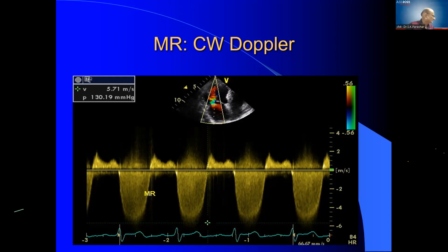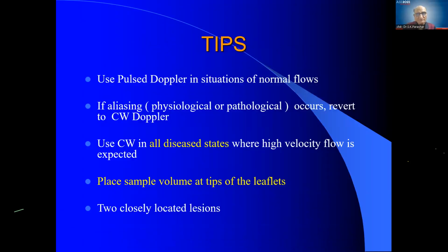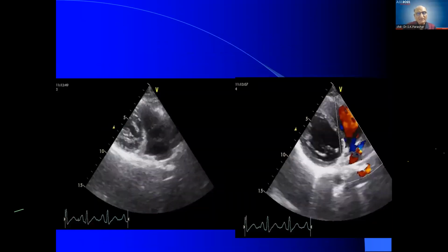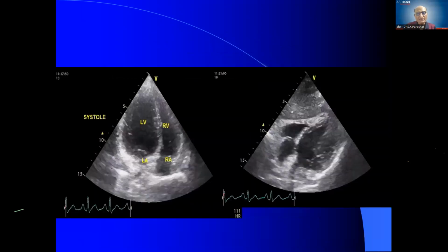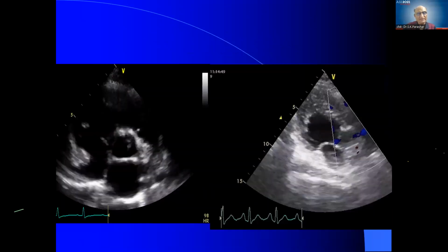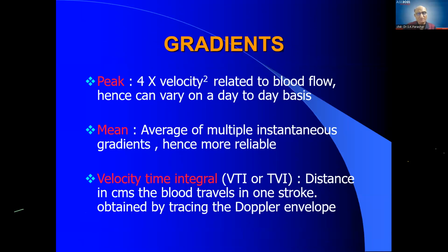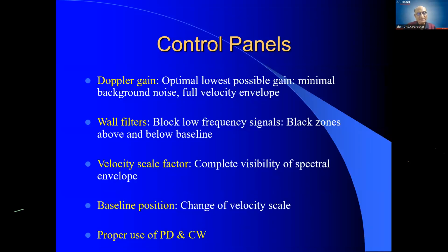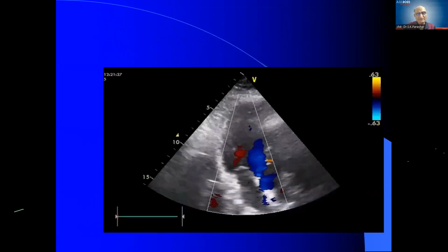But sir, in color flow mapping also there are options to adjust, on the top right side. Color flow mapping is based on the principle of a pulse Doppler, so aliasing also occurs in color flow mapping, because it is again based on the pulse Doppler.